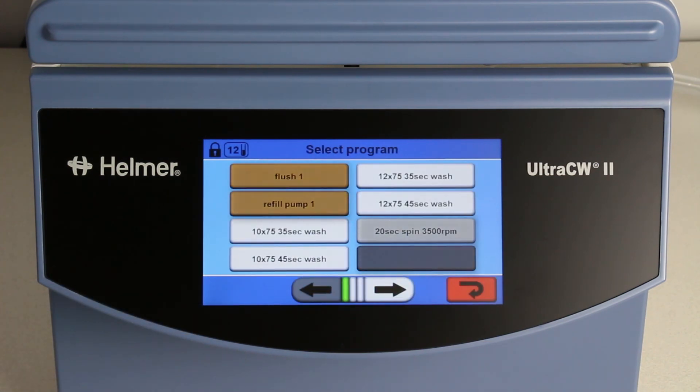The four wash programs provide wash cycles for either 10x or 12x75 tubes and either a 35 second or a 45 second spin, depending on your facility's preference.